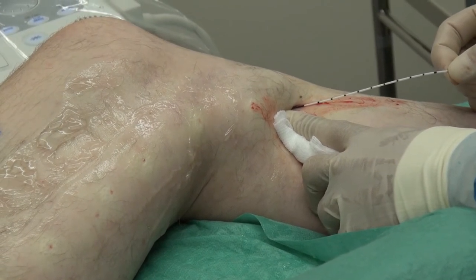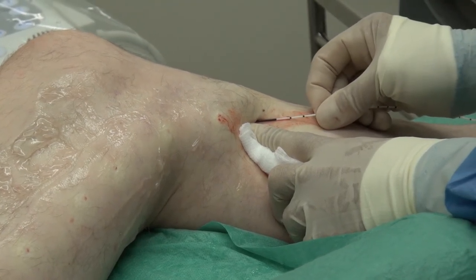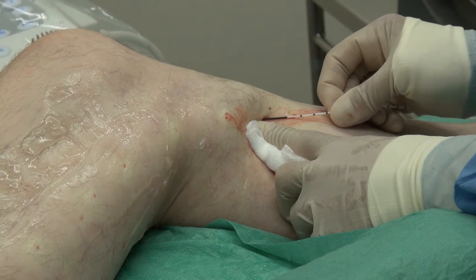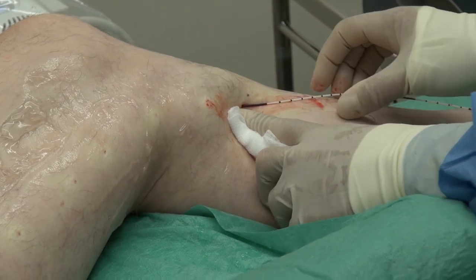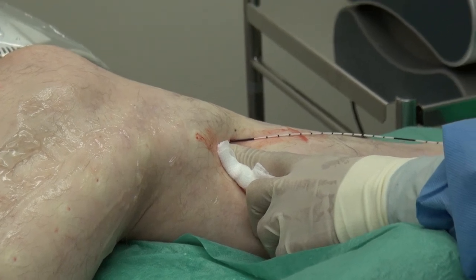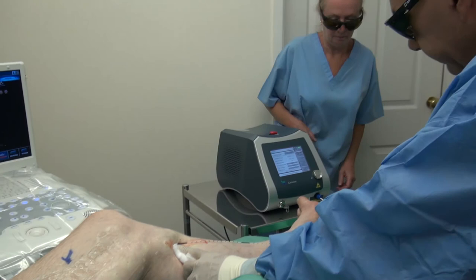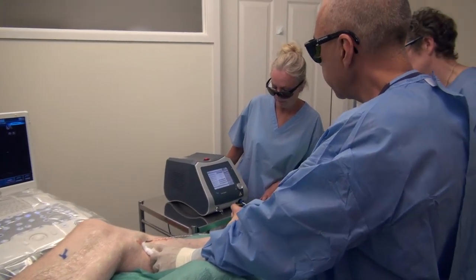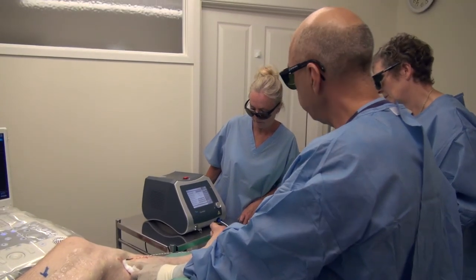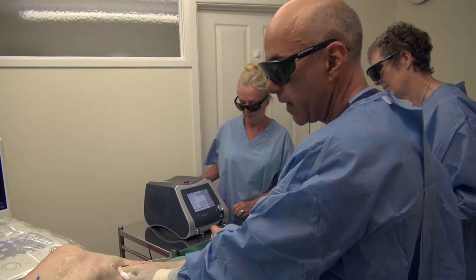The cannula is now very close to the exit point. I'm taking great care to make sure I don't inadvertently withdraw the cannula completely. I'm going to stop there. Jane will now disable the laser fibre machine. It's 3766 joules delivered to 49 centimetres of vein.